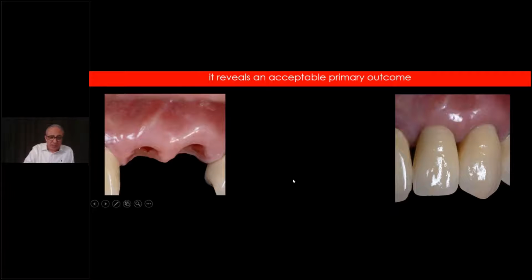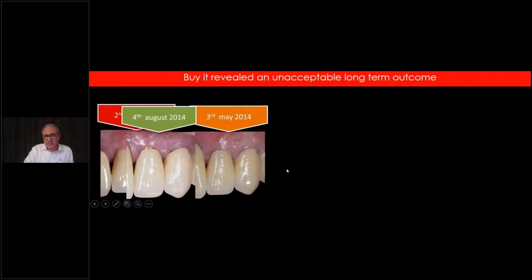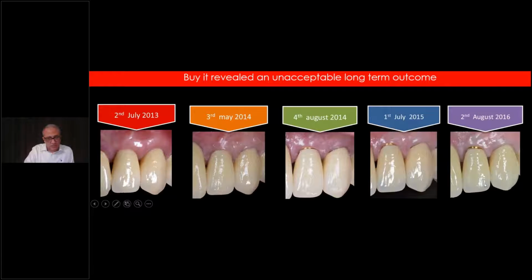You might have a wonderful result like that at the beginning, but then follow your cases up and you will find out that no, it doesn't work. There has to be something else that should be done in order to sustain this result of 2nd July 2013. You need to do something. So I believe that the first method is not really doing very good.